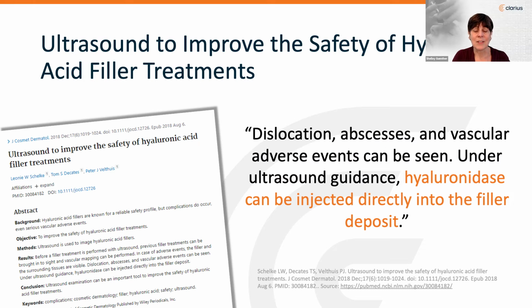Now, to set the stage for this presentation, I did a bit of review of recent literature, and there's a lot of great articles out there. The first one is from the Journal of Cosmetic Dermatology, and it reminds us that even though HA filler injections are relatively safe, complications can occur. And ultrasound is an invaluable tool, not only to improve the safety of HA filler injections, but in identifying complications that may occur and to guide treatment.